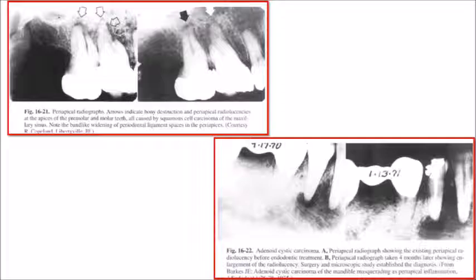The first radiograph shows radiographic features following squamous cell carcinoma — you can see destruction and periapical radiolucency around the premolar and molar teeth, with band-like widening of the periodontal ligament spaces typical of malignant tumors. In the second case due to adenoid cystic carcinoma, a periapical radiolucency was seen before endodontic treatment, and four months after treatment the radiolucency had enlarged — confirming it was not an endodontic lesion, and the diagnosis was adenoid cystic carcinoma.